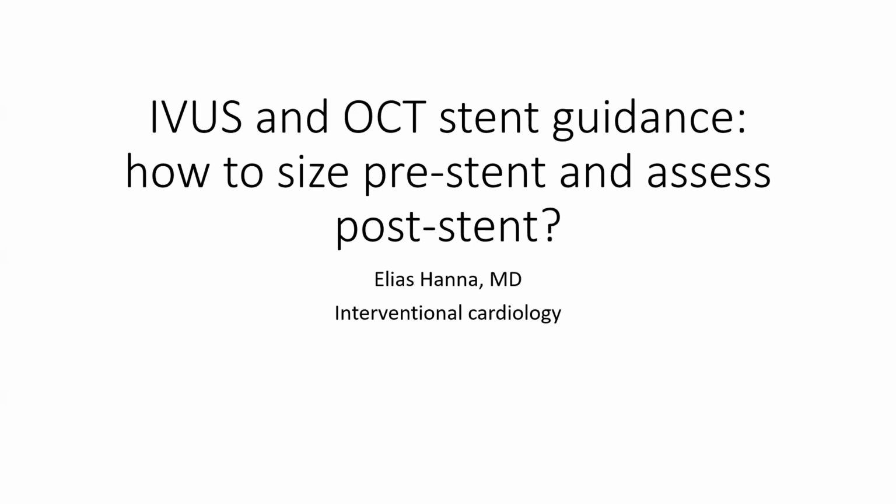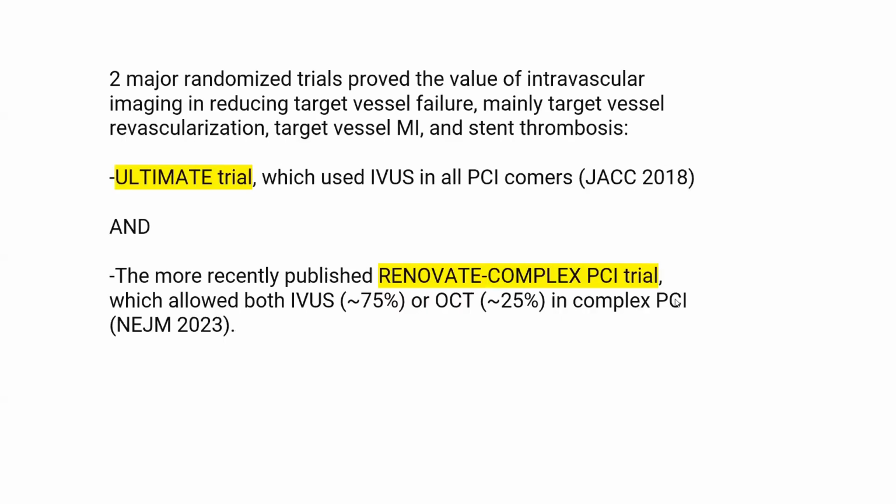The criteria I will use are obtained from the major trials. I tried to combine them and synthesize them for you. I suggest also that you review my 3 prior talks regarding IVUS and OCT imaging. This talk will complement the prior talks.